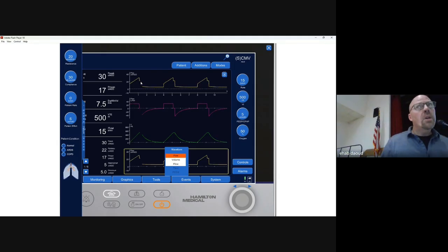The hold needs to be like a couple of seconds, but at least it gives you an idea of the peaks. Yeah, good. But again, real quick, if something changes with your teaching strategy, you can modify the simulator with a different approach. So putting an inspiratory hold on a breath is a practice that's commonly done outside the United States. You see this all over Europe where they just put inspiratory holds on so they can routinely monitor plateau pressure.